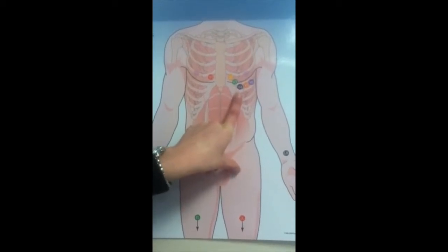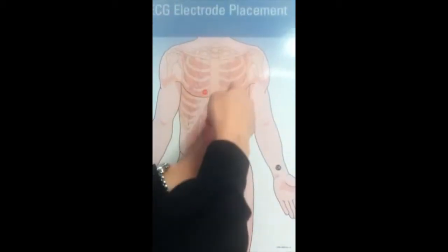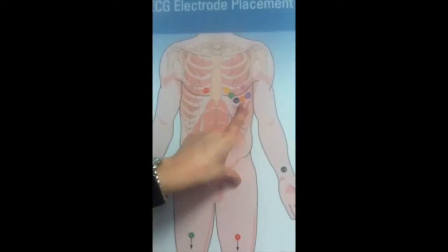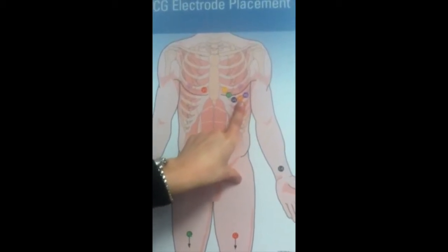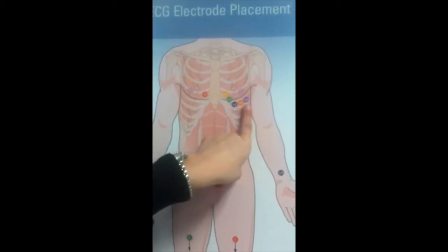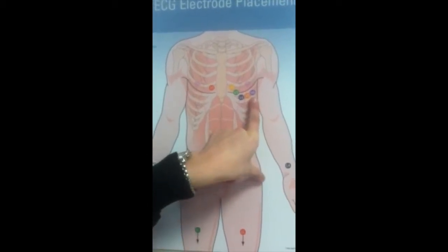The fourth lead is at the mid-clavicular line in the fifth intercostal space — as you can see, it's in the middle of the clavicle. The fifth lead is at the anterior axillary line on the same horizontal level as V4. And the sixth lead is at the mid-axillary line on the same horizontal level as V4 and V5 — so it's under the armpit area.